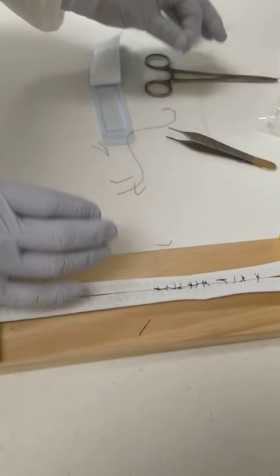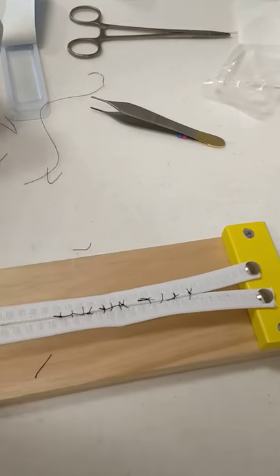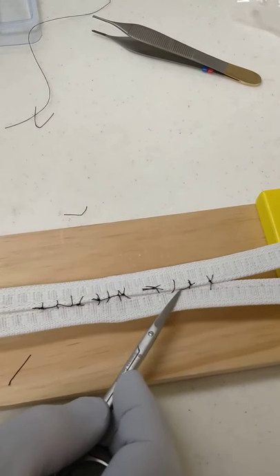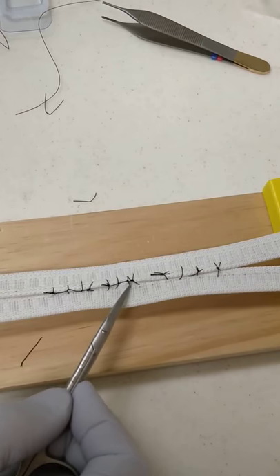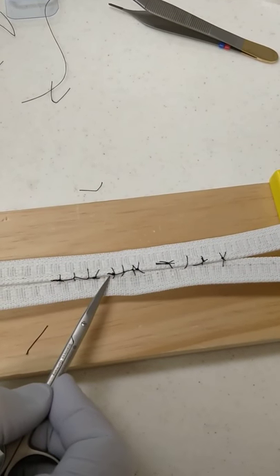So there you have three types of continuous sutures: a baseball suture, a continuous locking suture, and a continuous unlocked suture.